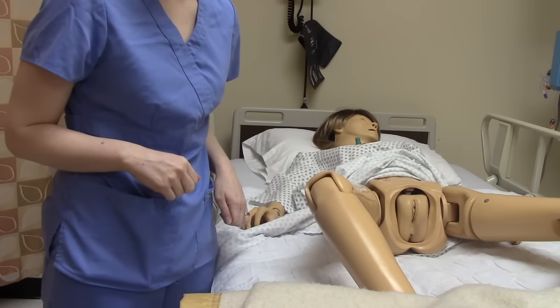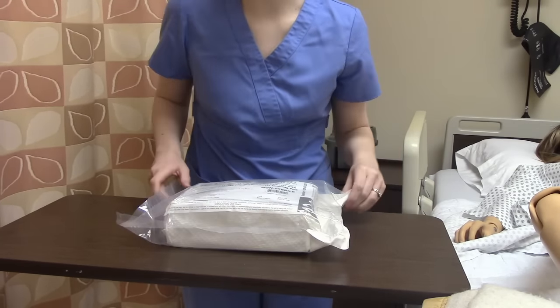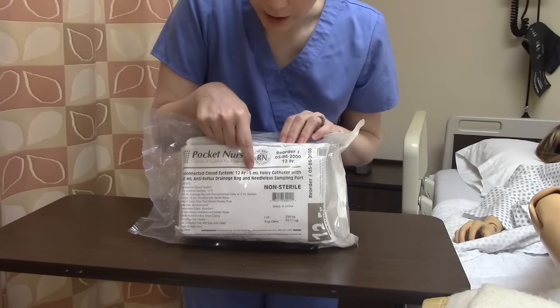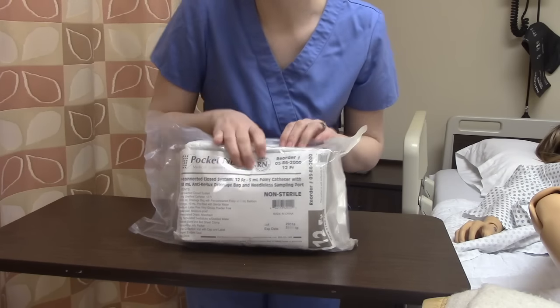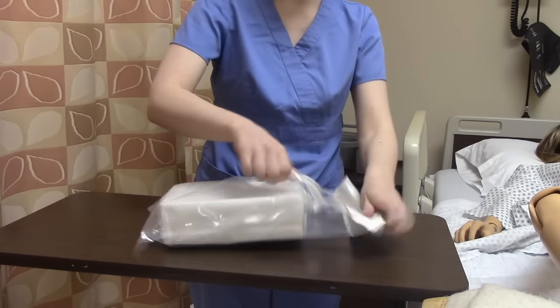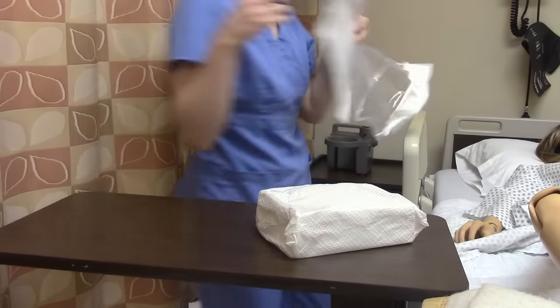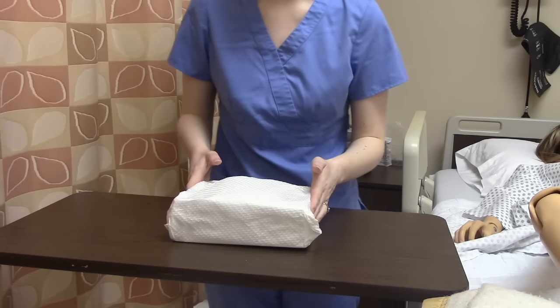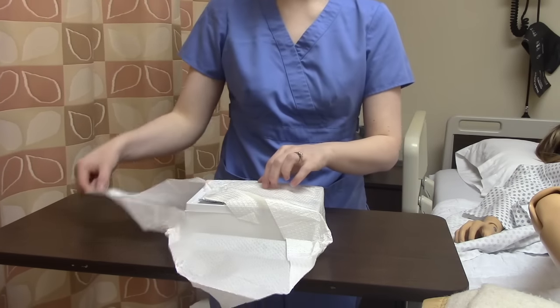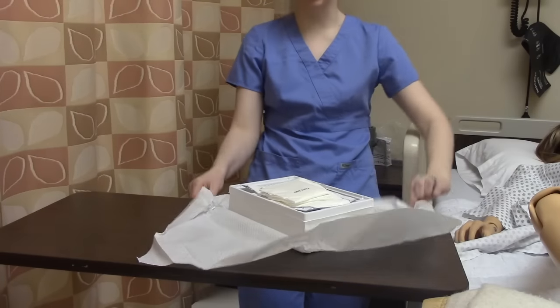So let's do a female Foley on this patient. We're going to open our package. This is a 12 French and we can put 5 mls of fluid into the balloon. We're going to open our sterile package the correct way — away from us, side, side, towards us, and then I always do a little turn like that. Remember, our border is one inch and is not sterile.